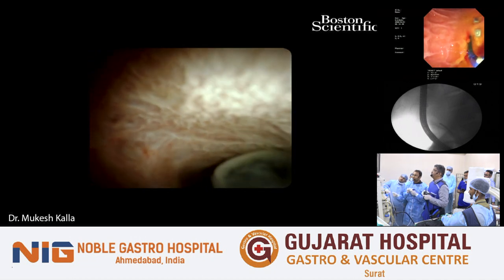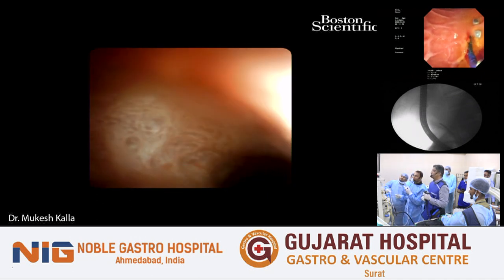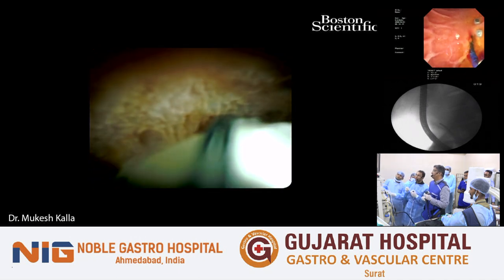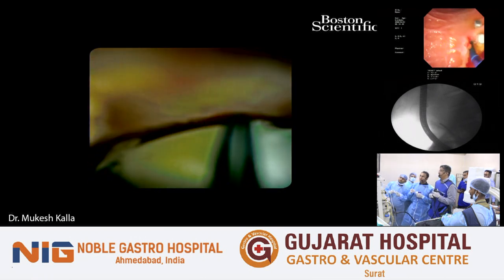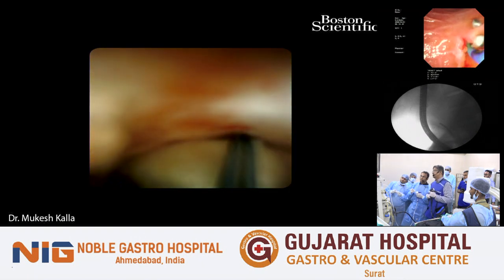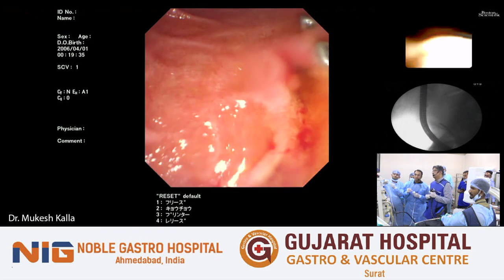So I will use my up and down knob to go close or to go away from the stone instead of manipulating. Yeah, wonderful. Somil is too good at holding the stones. He picks them up very well. Nice one. So I think he held it. We saw the end of the cystic duct and we were able to take it out. Really, let go. Release. Let go. Take out the basket.